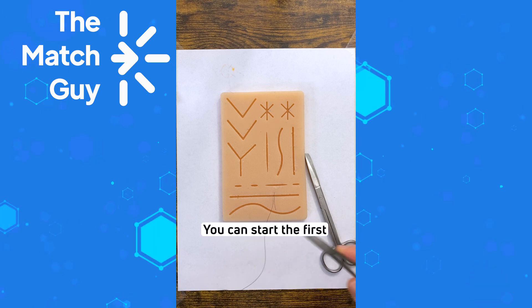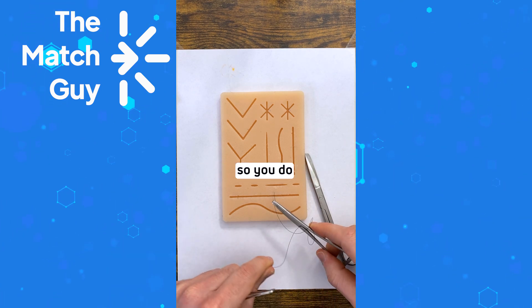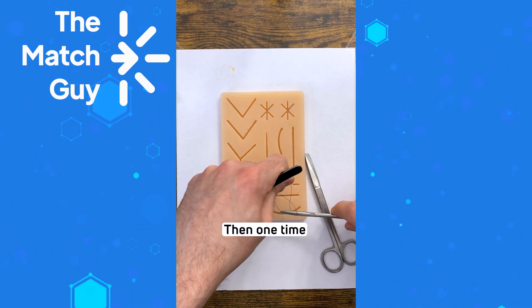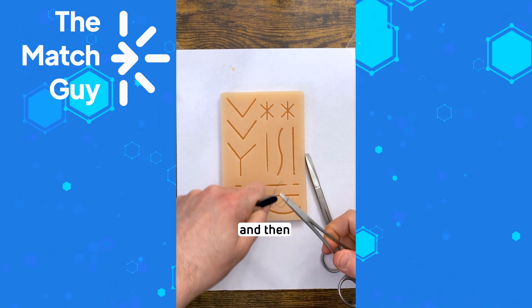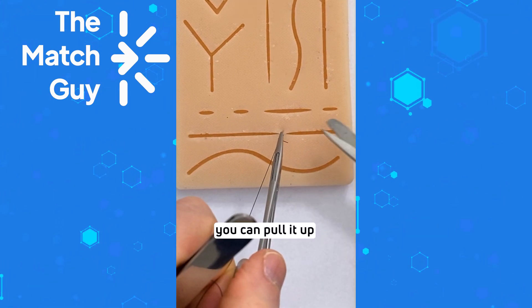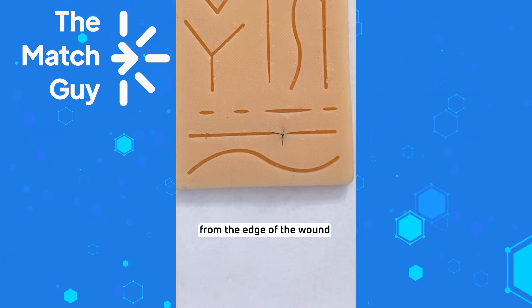Pull out without pulling all the suture out, and then tie your suture. You can start the first throw as a surgeon's knot: wrap it around the needle holder two times, then pull, then one time, then one final time — three total. Then you can pull it up and cut the suture around a centimeter from the edge of the knot. And that's it.